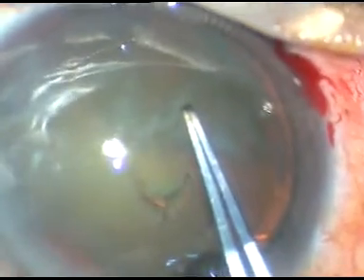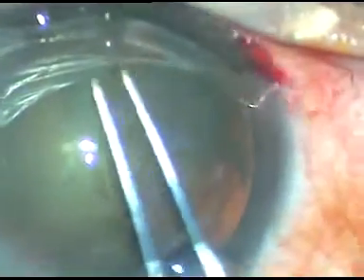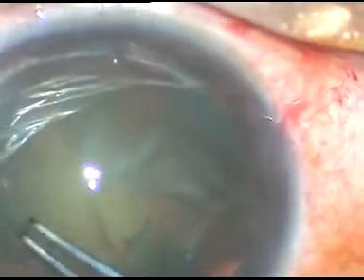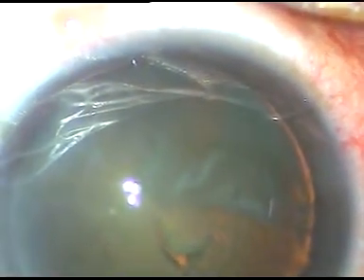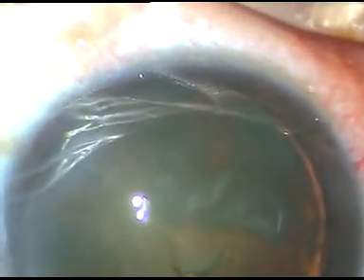Now in this case visibility is not very good, so I should have injected trypan blue dye. Anyway, I can see the rhexis margin, and at the end when I have completed the rhexis, I see that the rhexis size has become a bit small.